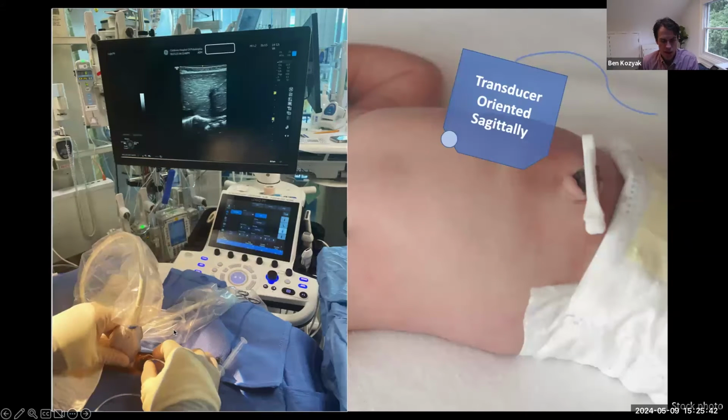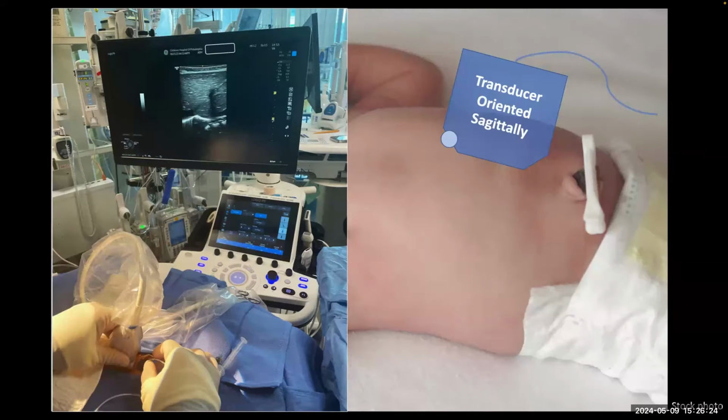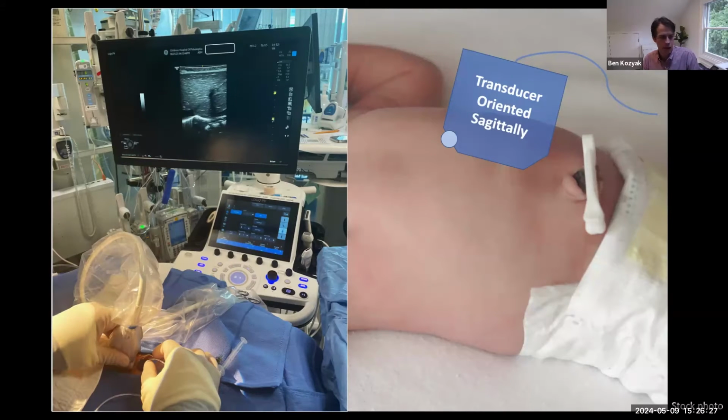I find it way easier to drape a wide sterile field and put a sterile cover over the ultrasound probe so that you can do both imaging and catheter manipulation yourself. Some people like to do it with a second set of hands, where they have a friend image non-sterilely under the drapes while they manipulate the catheter sterilely. I find that clunky. When you're doing it all yourself, your left hand knows what your right hand is doing, and vice versa, so you can see what you're doing more easily and follow what you're doing more fluidly and make adjustments as needed along the way.